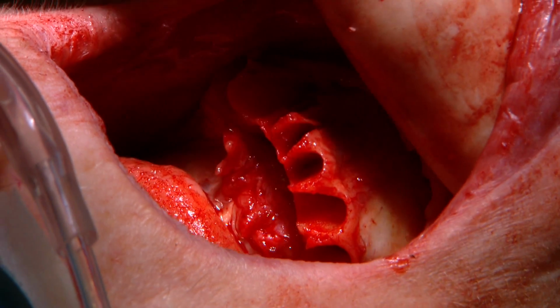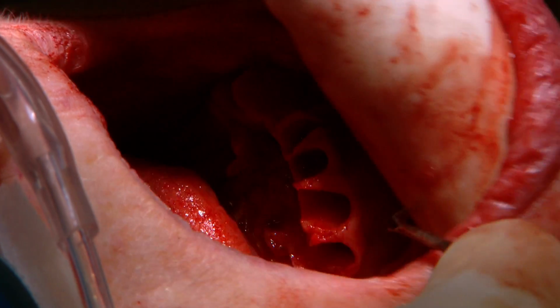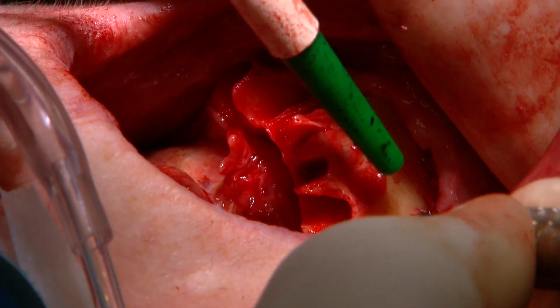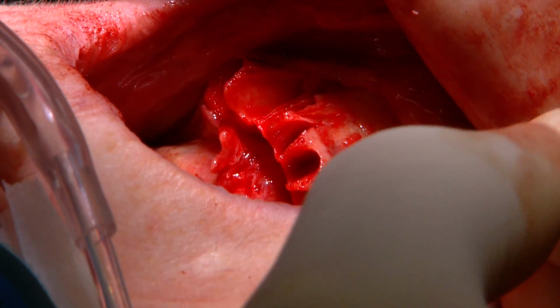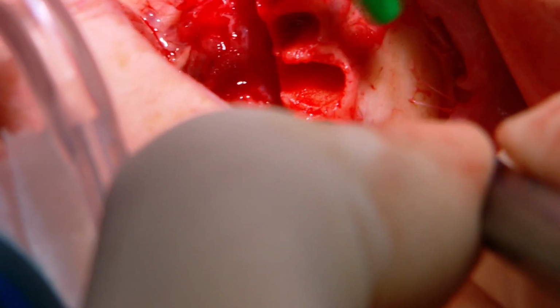They run through the lower jaw and they exit about this position here. They're the nerves that supply the lower lip. And when we're doing a lower all-on-4, we have to identify those nerves, so we just know where they are and we keep well clear of them. So what we do now is we mark the nerve, so it's obvious for everyone, so they know exactly where it's lying underneath.